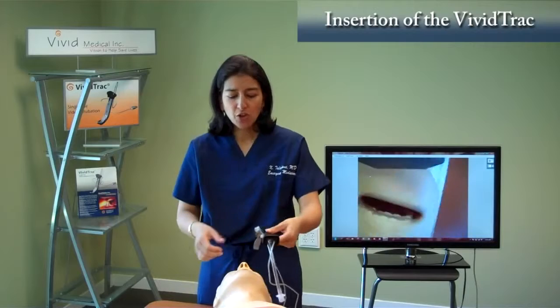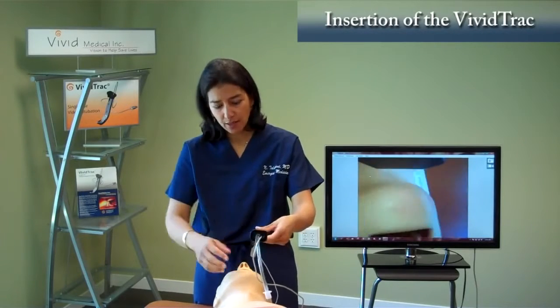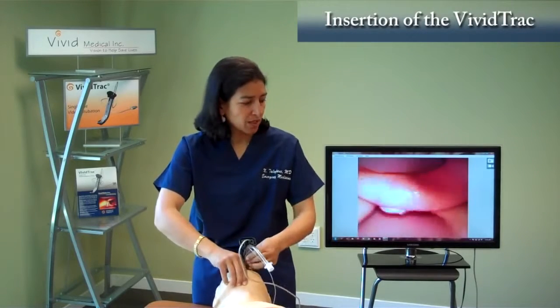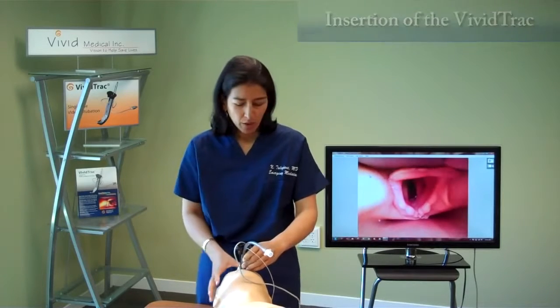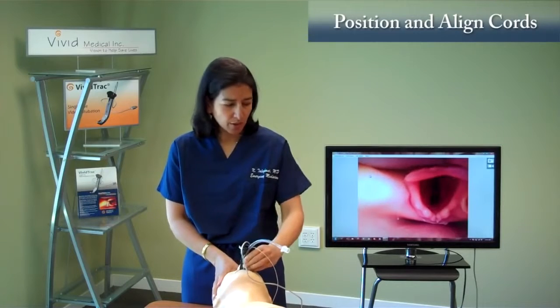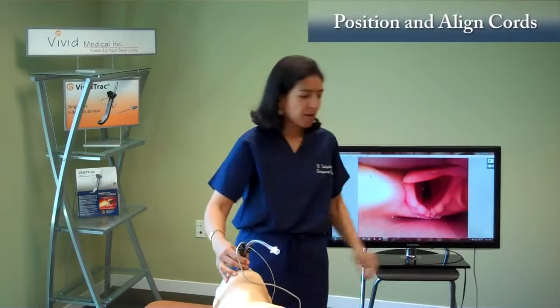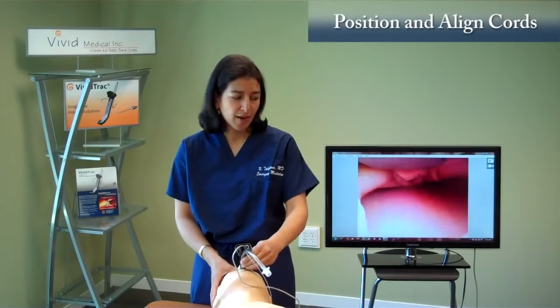What you want to do is gently hold the device parallel to the patient's thorax. You enter the oropharynx, and as soon as you enter the oropharynx, you will see the cords. You can move the device from side to side to align it to the position that you like, but ideally you want your entire anatomical structure visible. You don't want to have pushed the device too far in or too far out.